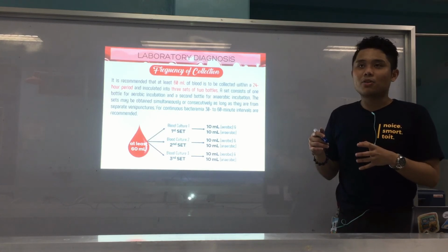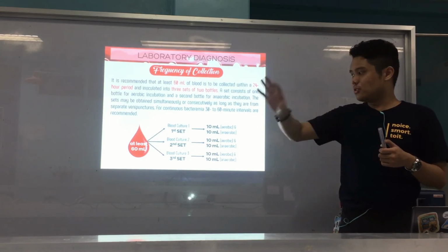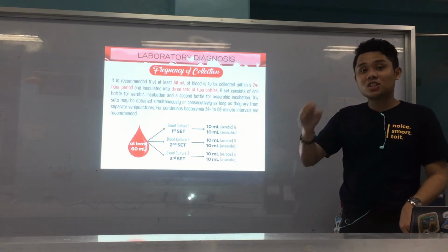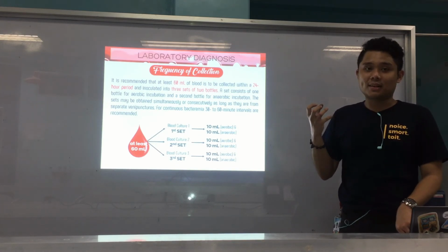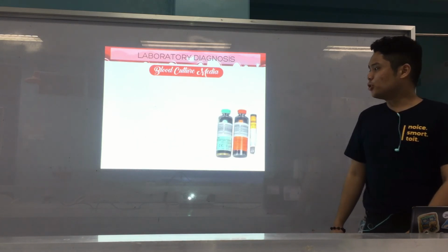Bahalag dili jud ka makaingon na sige siyang naa didto, inana ba? So at least by the volume, the amount nimong nakuha, you can say na again there could be a chance, okay, or higher chance of really isolating or collecting the pathogen from the blood. Okay? All right. Okay, now we now go to your blood culture media.